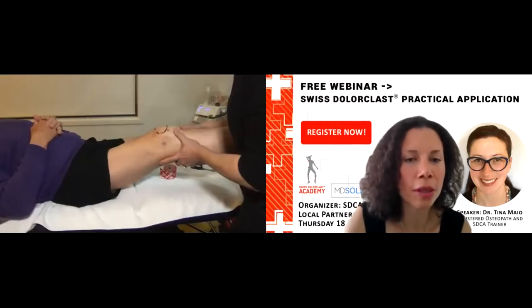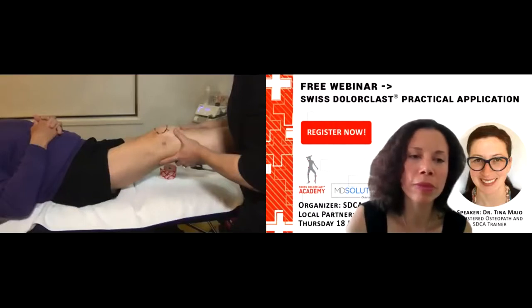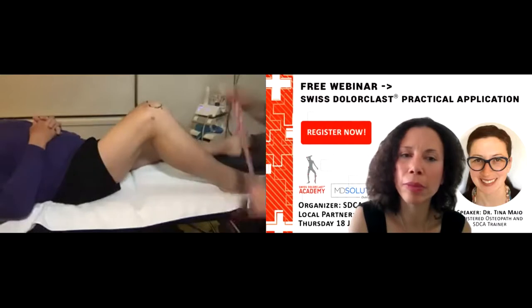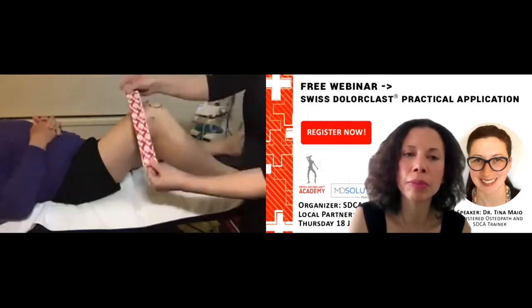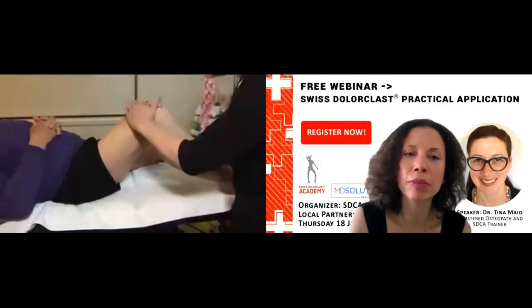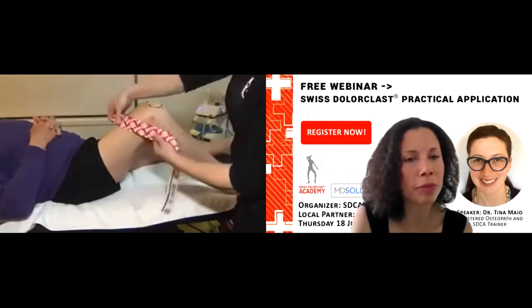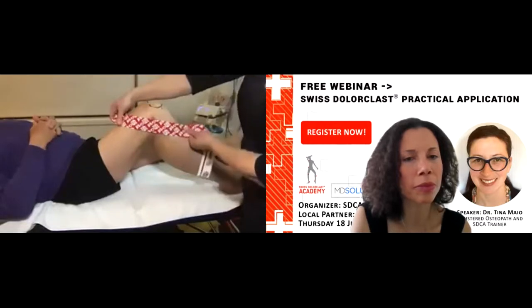So we talked about reinforcing the movement that we're trying to achieve with the shockwave and making sure we've got some support. So I'm using some active tape here. Just a strip that's probably 2 feet long. And I'm going to start roughly one hand above the knee. And because I want internal rotation, I'm going to come around the outside of the knee here, and then I'm going to wrap around the shin.